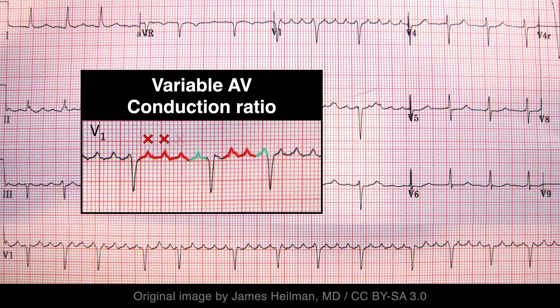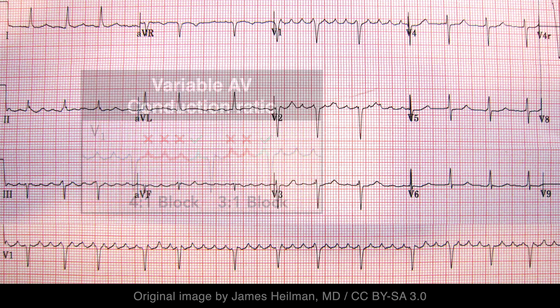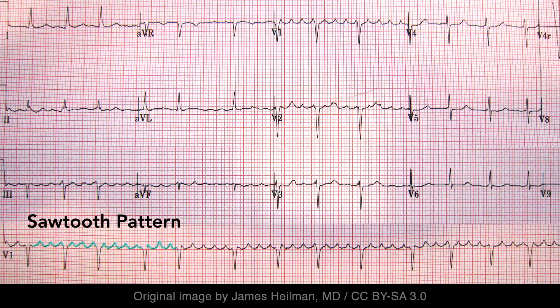In this case, the conduction is variable, alternating between 3:1 and 4:1, meaning every third or fourth flutter wave conducts to the ventricles. To summarize the most important findings: atrial flutter classically results in a sawtooth pattern, and conduction delay at the AV node typically results in a degree of AV block.